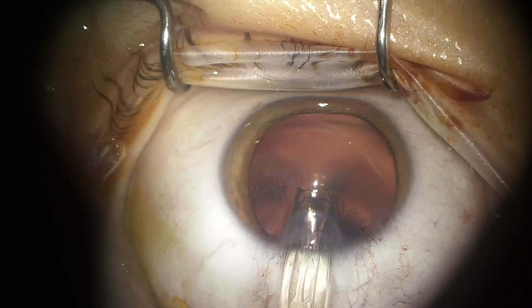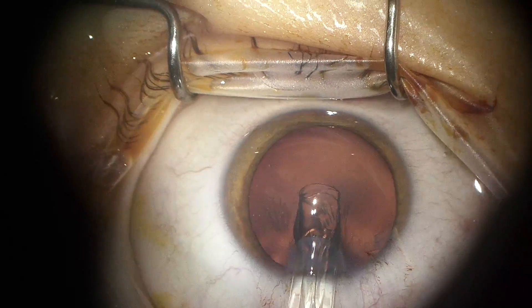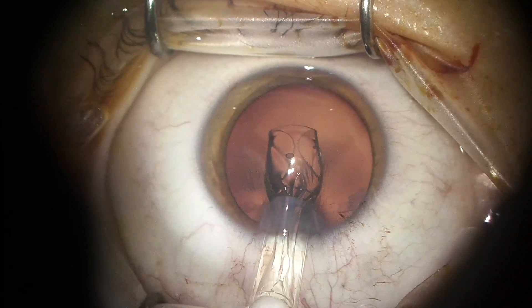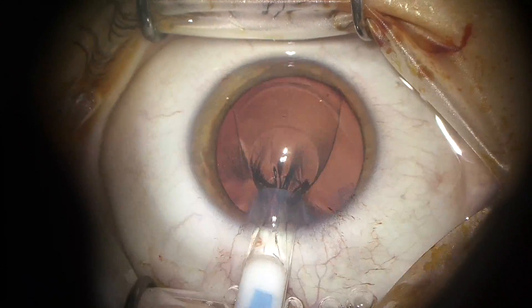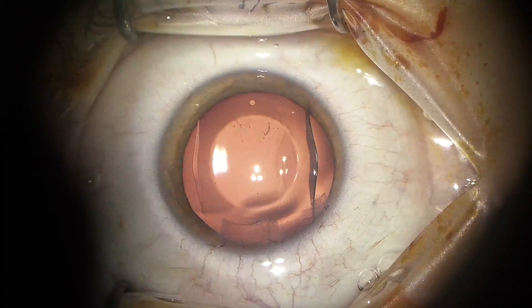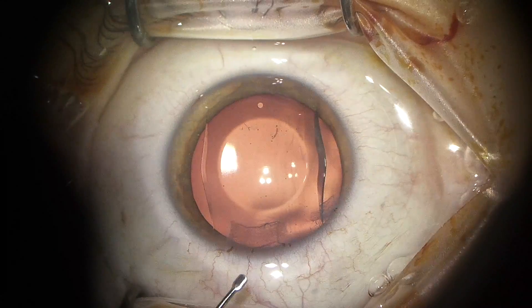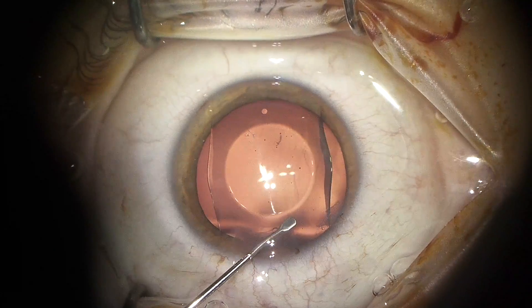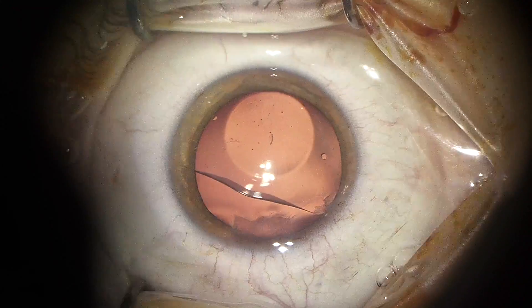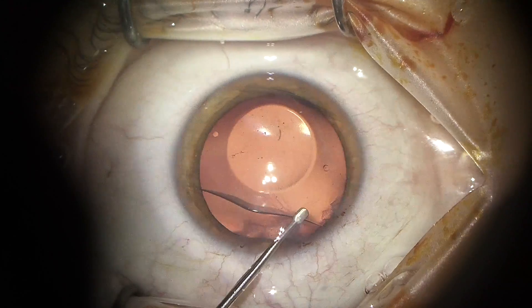Now I'm going to go ahead and inject the implant through the main incision. It inserts beautifully and gently right in the place that I want it in the anterior chamber. I'll take the Bayer manipulator and twist the implant horizontally, because I'm sitting at the top of the bed and I want this lens to sit side to side.